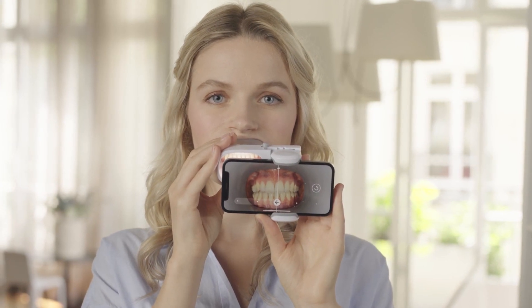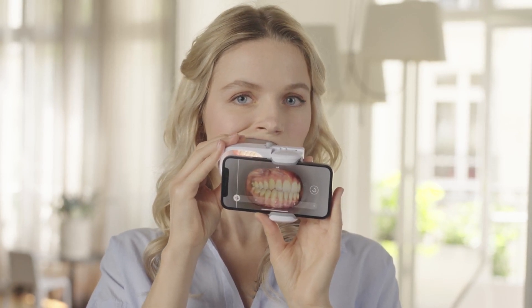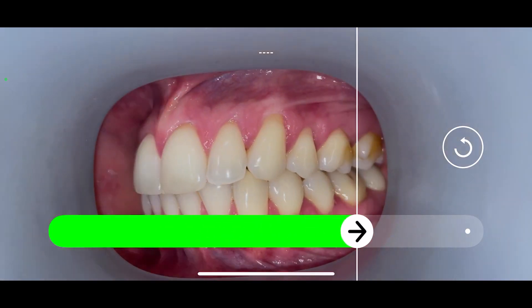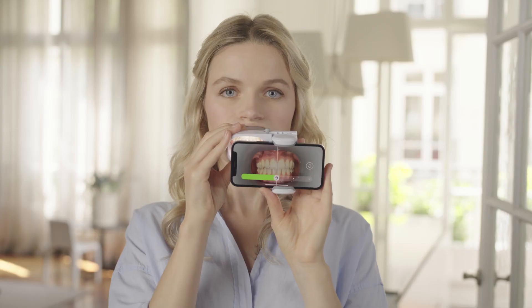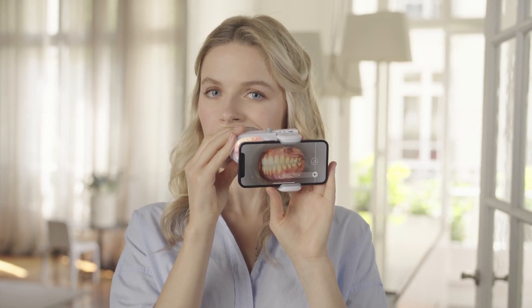Shift the scan box to one side. Start moving your head as soon as you hear the camera make a sound. Now shift the scan box to the other side. Make sure you move the scan box at the same rate as the progress bar. Scan all the way to the side to make sure your back teeth are well seen. You can also turn your head slightly in the opposite direction if that is easier. Back to the center.